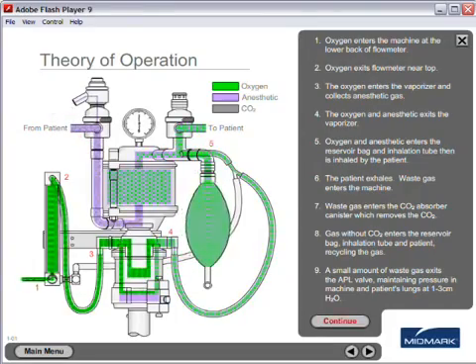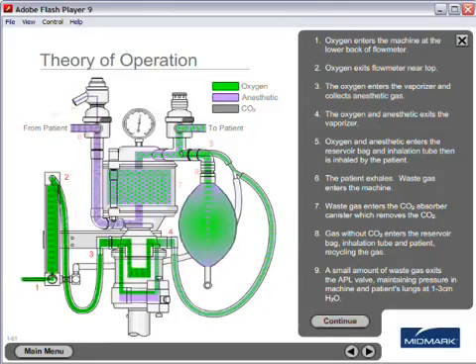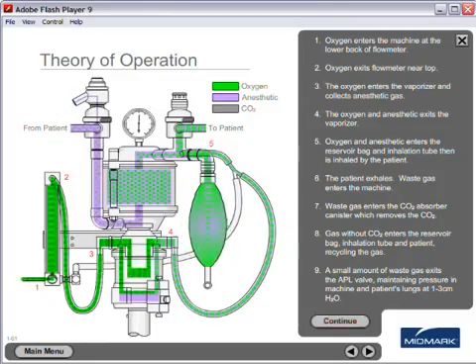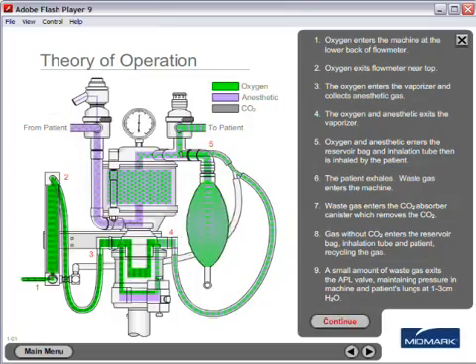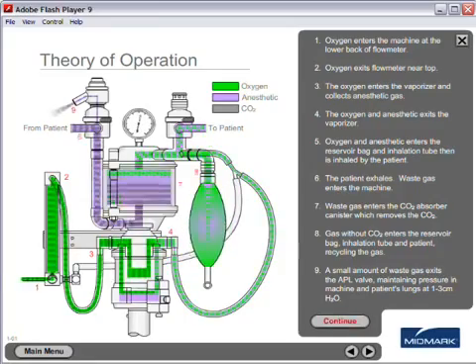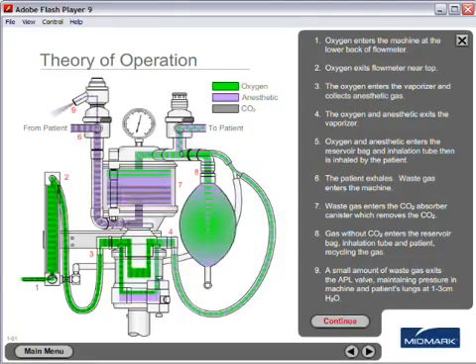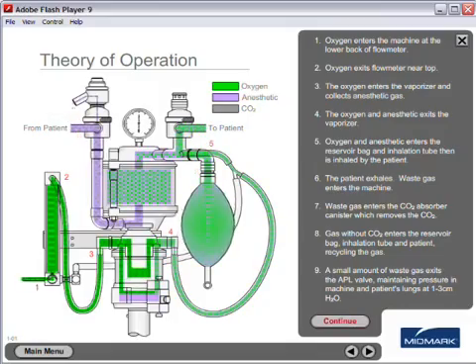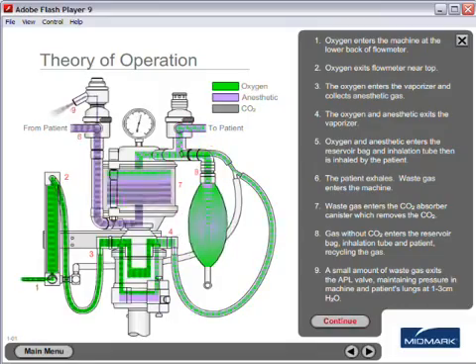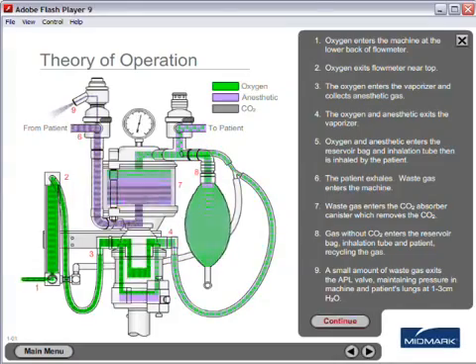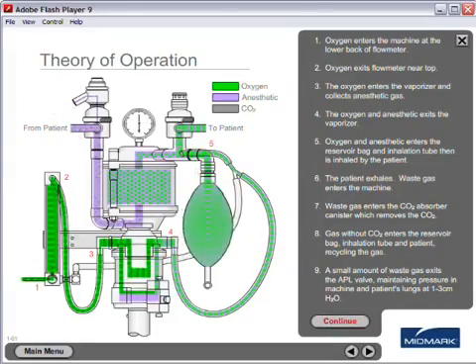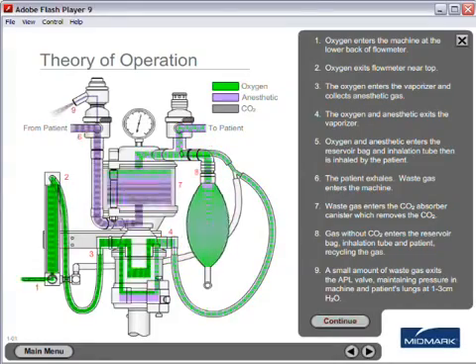Number five, oxygen and anesthetic enters the reservoir bag and inhalation tube, then is inhaled by the patient. Number six, the patient exhales and waste gas enters the machine. Number seven, waste gas enters the CO2 absorber canister which removes the CO2. Number eight, gas without CO2 enters the reservoir bag, inhalation tube and patient, recycling the gas.